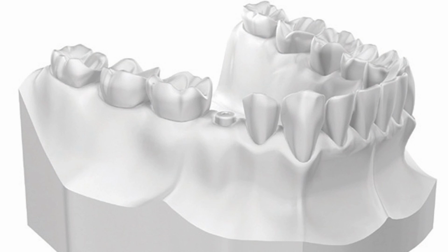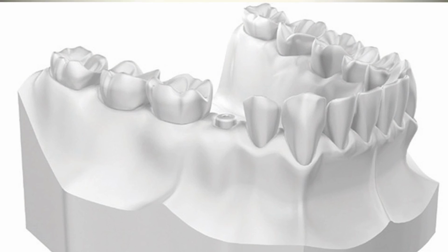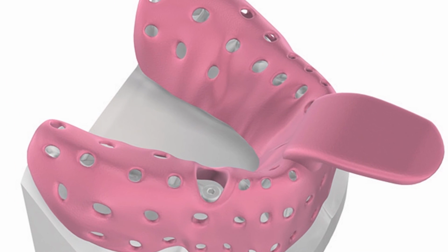If you see this picture right here, we have a model with a healing abutment on for a patient. In the next picture, you can see that they have taken, in this case, what looks like a custom tray in which they've made a lot of perforations inside the tray.